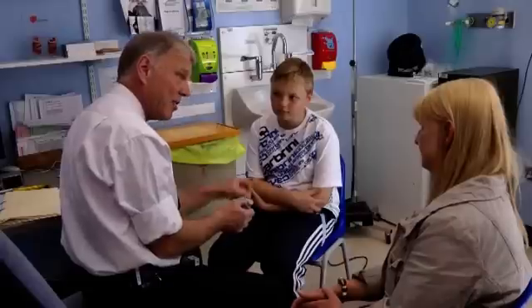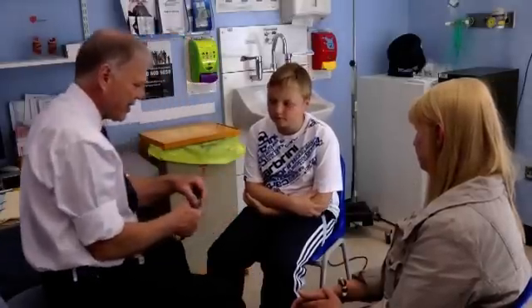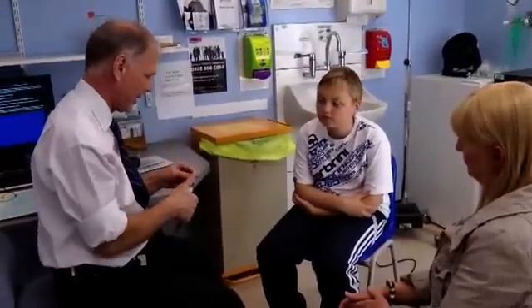Then remove the EpiPen. The reason we need to hold it in position is because it does take a little while for the medicine to go into the muscle, which is what we need. What we don't want is for it to jump out — if the needle came out again it won't have had time to go in properly. Do you understand all that? Yeah.